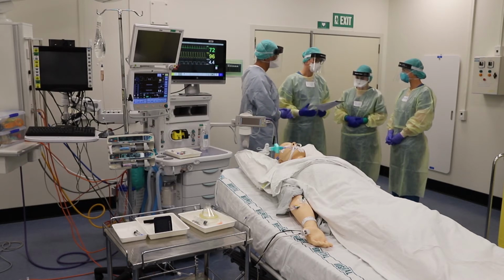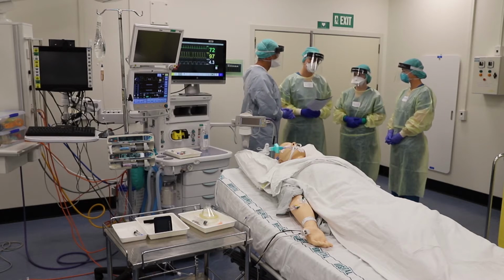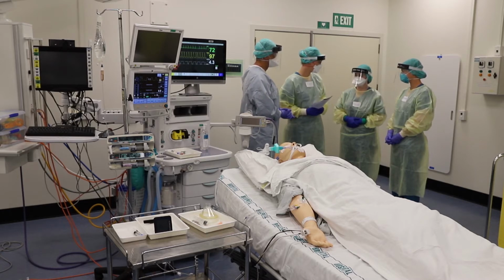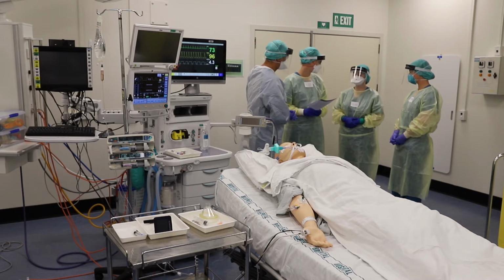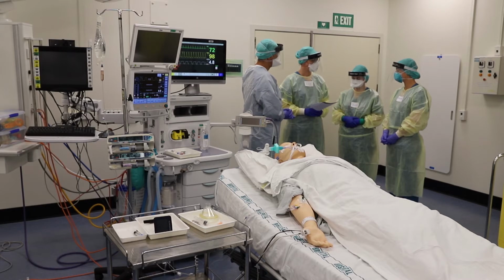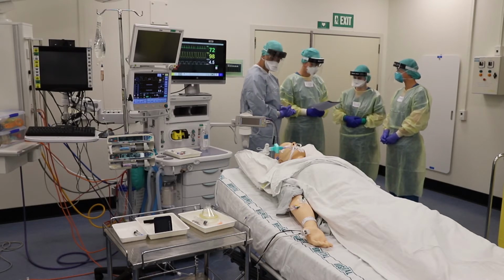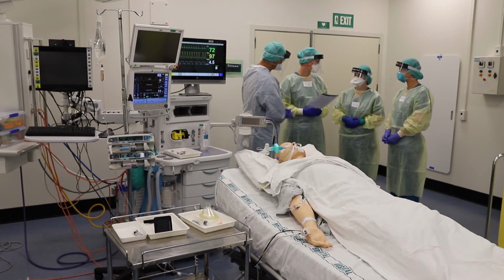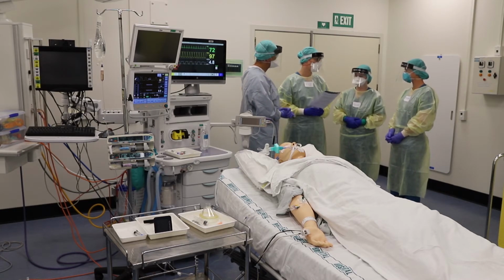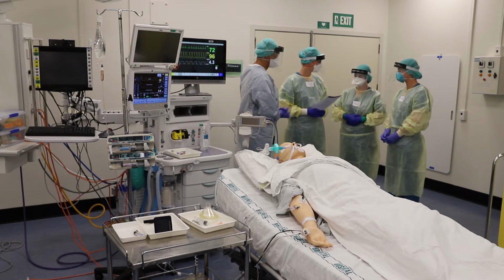Now, my plan is to recover him myself in theatre, but we should inform PACU that we're about to extubate. Olivia, would you mind calling in to let them know? Sure, I'll notify them now. Thank you. Does anyone have any other concerns? No. Okay, great. But please do speak up if we've forgotten anything or you have any concerns while we extubate. Sounds good. Thanks.